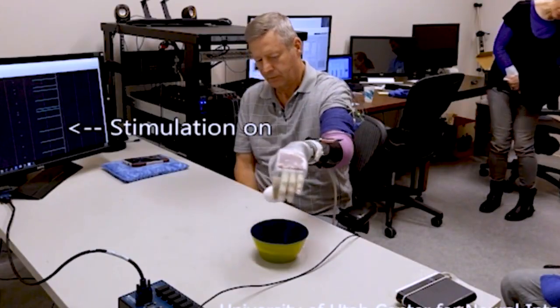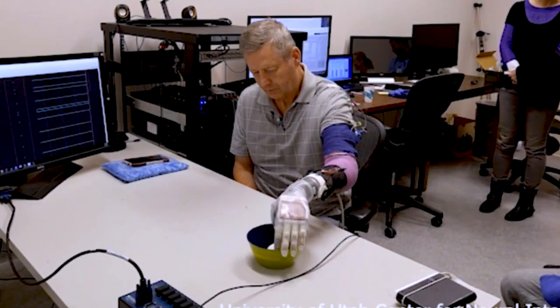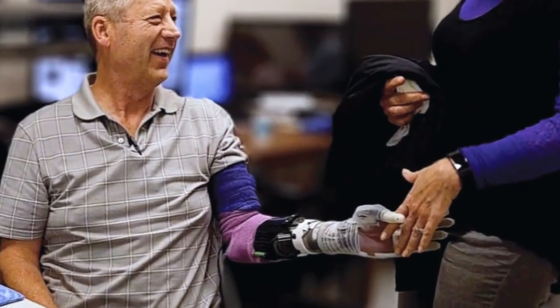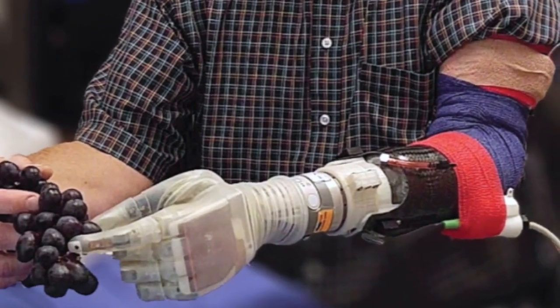Along with the arm, you can see the team implants small wires in the patient's bicep and forearm, which communicate back and forth with the new hand, just like a biological one.